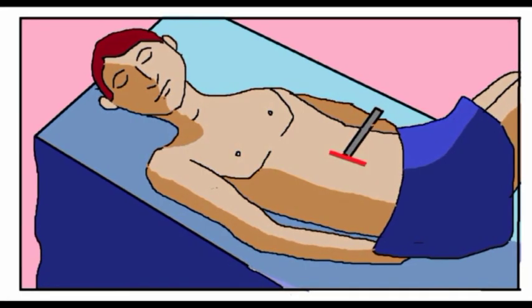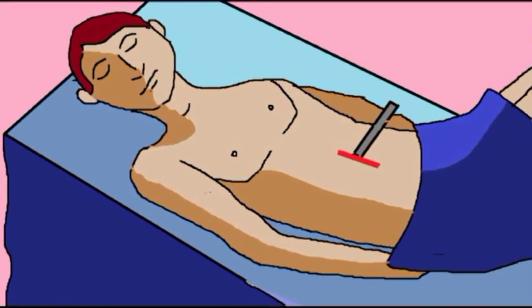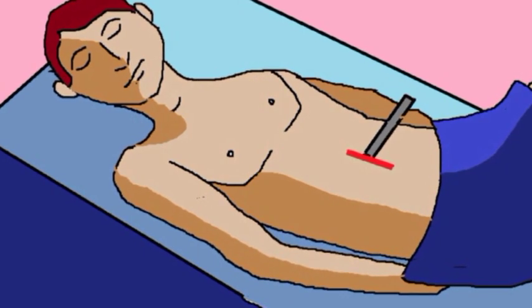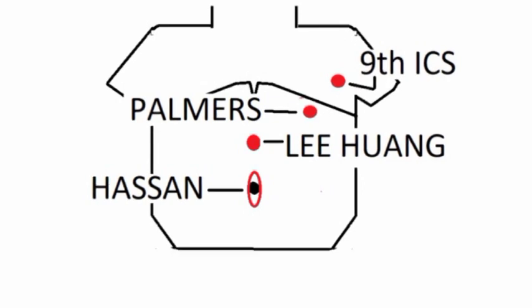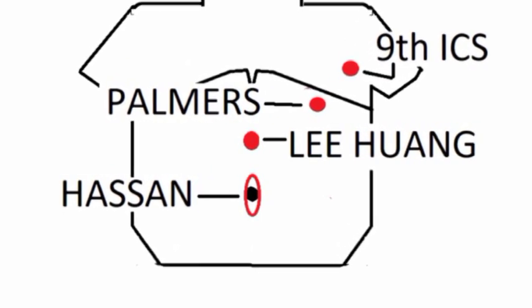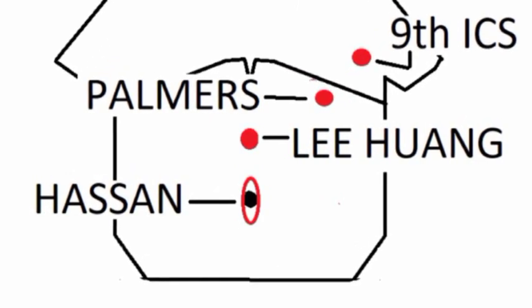Apart from this, there is the open Hasson technique, where a blunt trocar is introduced through the umbilicus with a vertical incision and a pneumoperitoneum is created. All these points were used and they mitigated the problem of laparoscopic surgeons in cases of previous adhesions. But these points too were not free from complications and there were contraindications to use them.